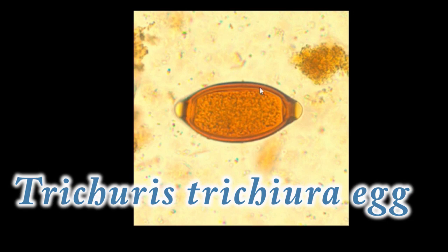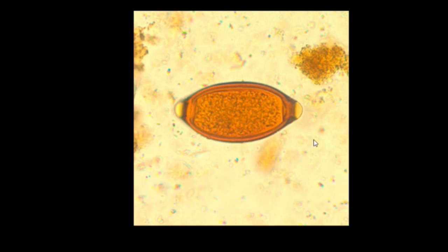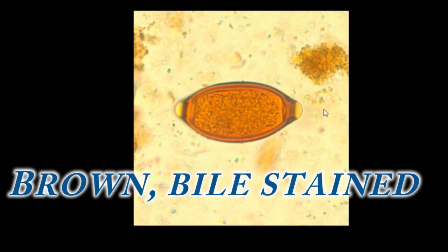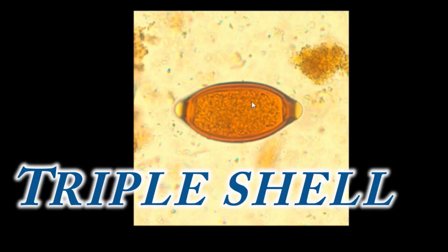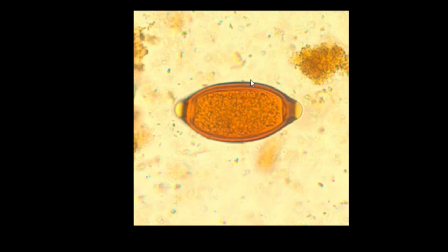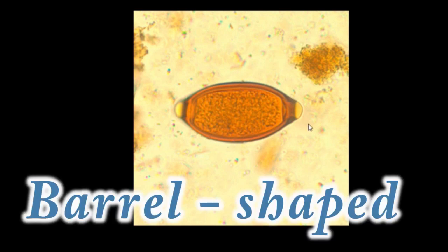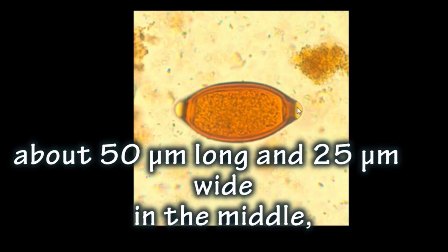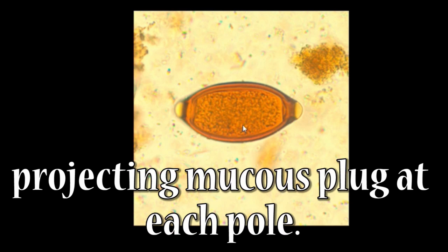This is the Trichuris trichiura egg. The egg has a characteristic appearance — it is brown in color, being heavily bile-stained. It has a triple shell: outer, middle, and inner layer, with the outermost layer stained brown. It is barrel-shaped, about 50 micrometers long and 25 micrometers wide in the middle, with a projecting mucus plug at each pole. You can see there are two mucus plugs.